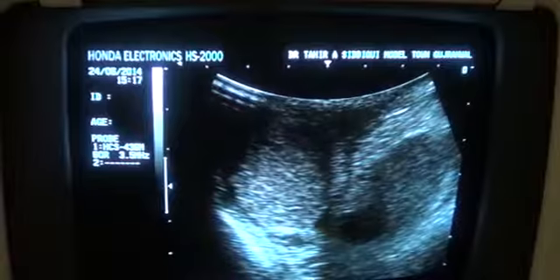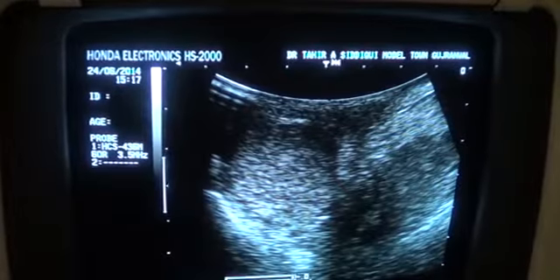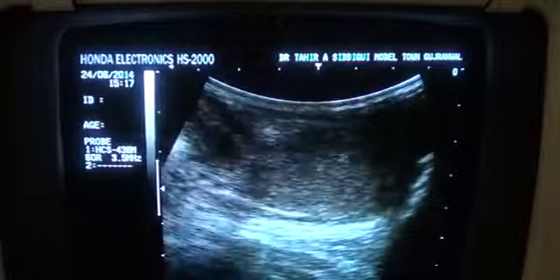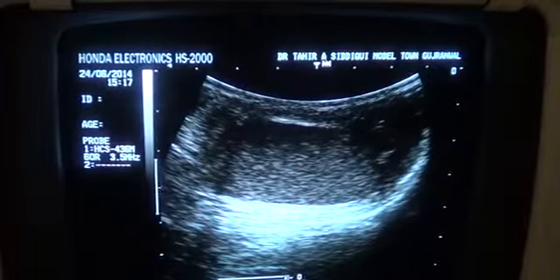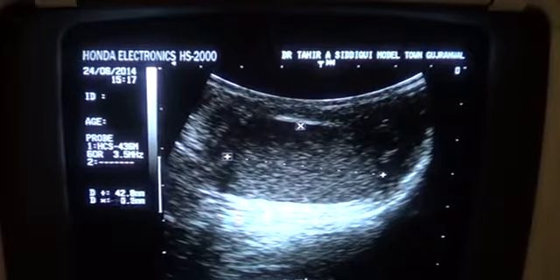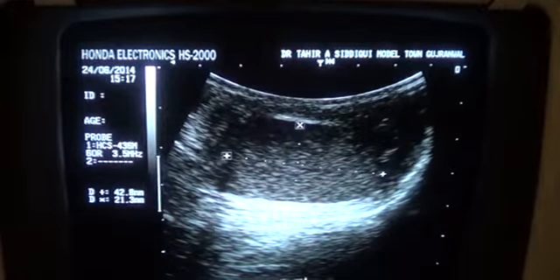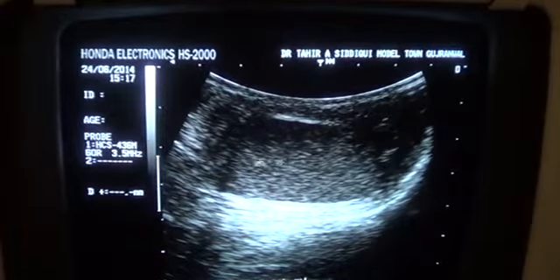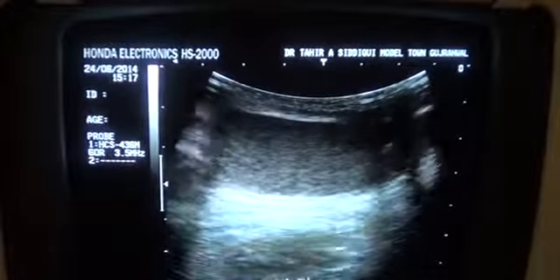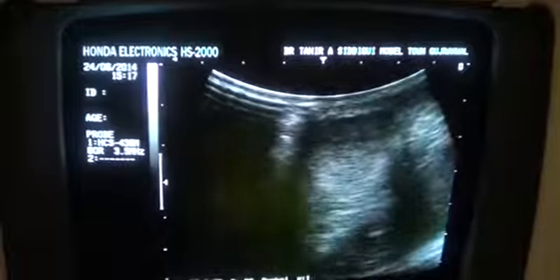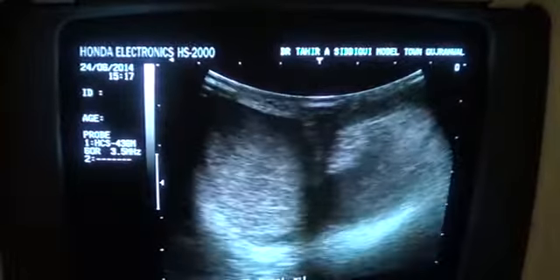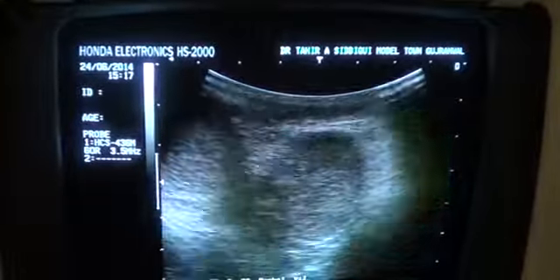First, let's see how the normal side looks. This is the right testicle — the transverse section and the longitudinal section of the right testicle. It measures approximately 4.2 x 2.1 cm. This is the mediastinum testis; it's normal, the wall is not thick or swollen. This is how the normal hemiscrotum appears under normal circumstances.